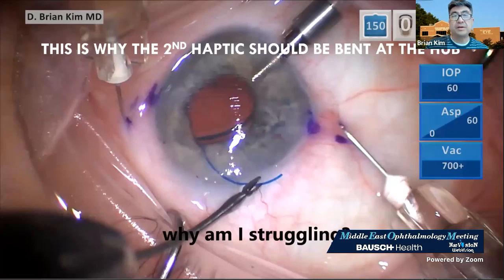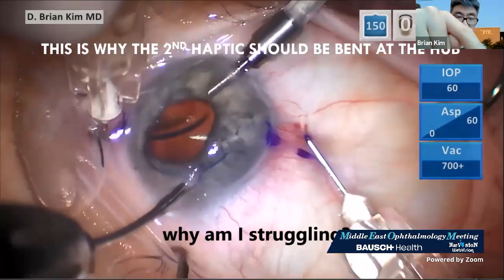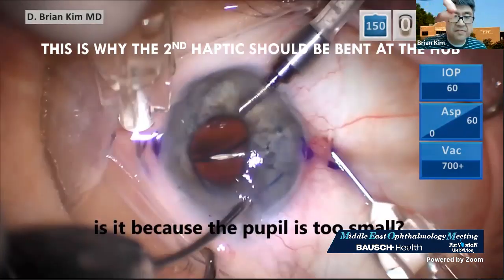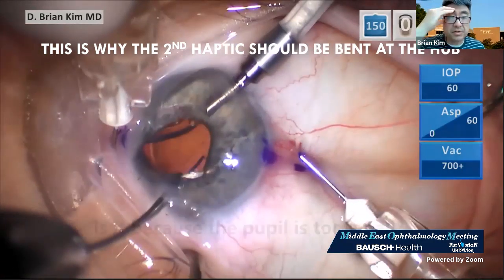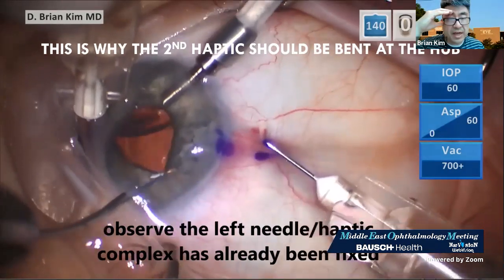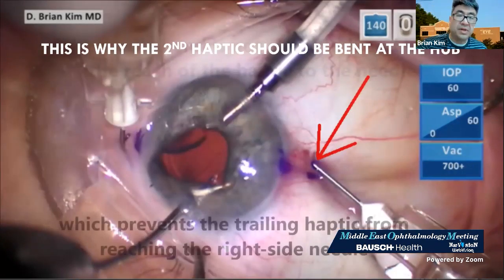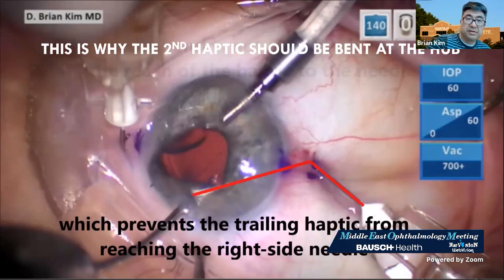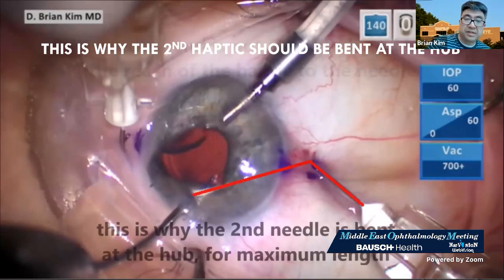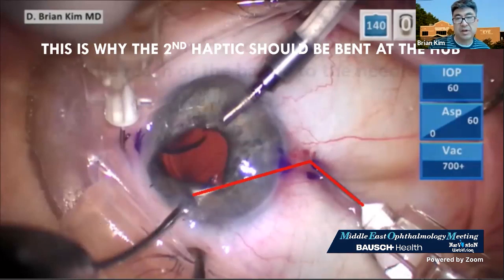So why should the second haptic needle be bent at the hub and not angled like the first one? You see the left needle is fixated already, but look, I bent it fairly close to the tip of the needle. And so as I'm trying to pass the trailing haptic through the right side needle, I'm having significant trouble because the left side needle haptic complex is preventing my ability to pass that right side needle through the trailing haptic.